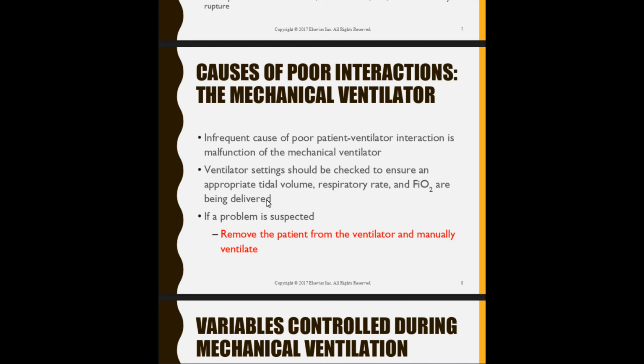You can do that. Don't be afraid. If the ventilator's not working or you feel that the patient's spiraling down, grab the Ambu bag. Bag them. It won't hurt. You're just basically helping them out, because if it's a ventilator issue and you manually ventilate them, then you're bringing the body back to homeostasis.